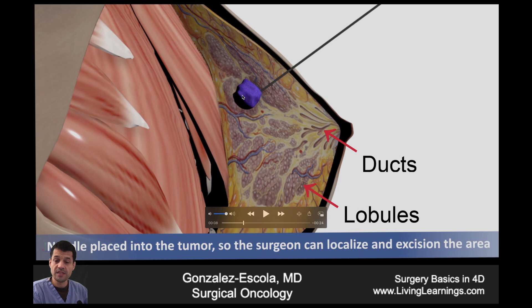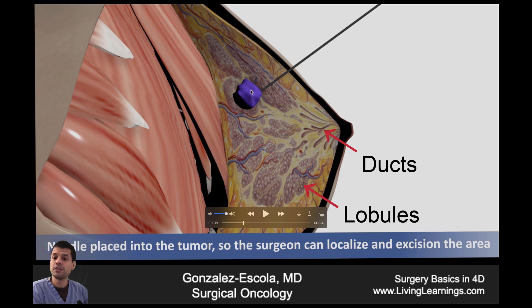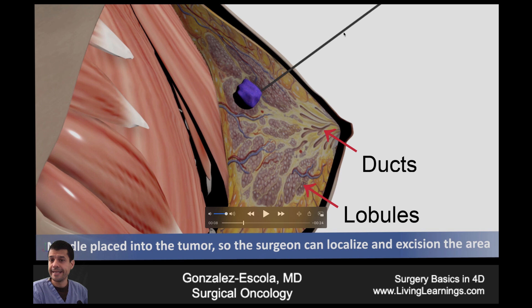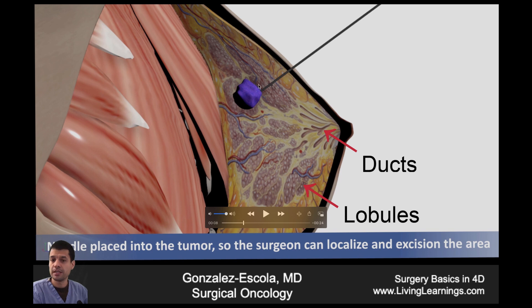As we see here, this is the lesion of concern and the needle is used for intraoperative localization.